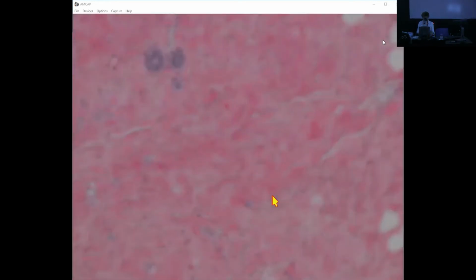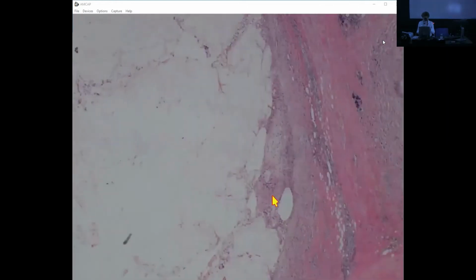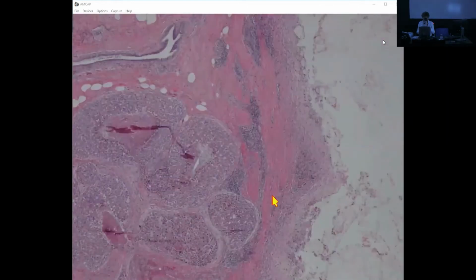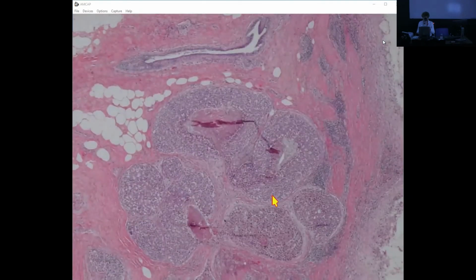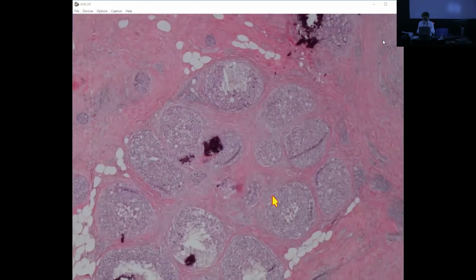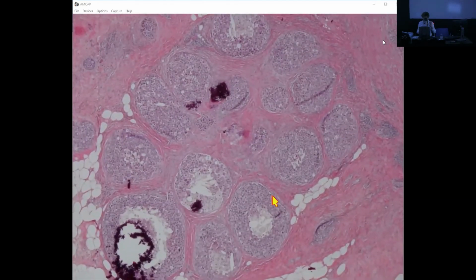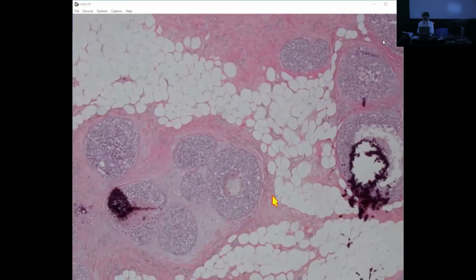Here is another case. Again, we're looking at this spectrum of lesions here. Another case where a biopsy must have been done. How about this one? It has big nuclei even at low power, right? Actually, that's not a diagnostic feature, but it is something I use in practice.